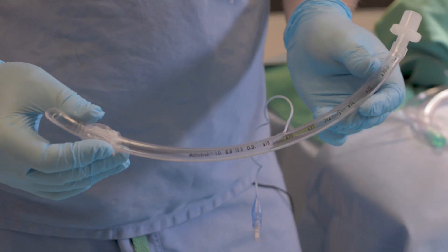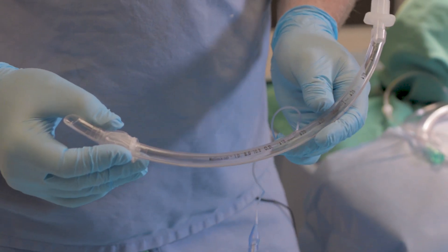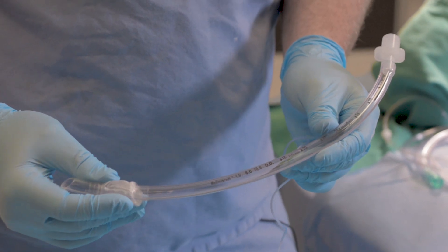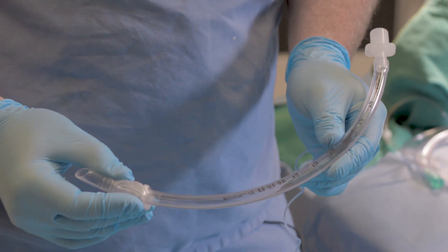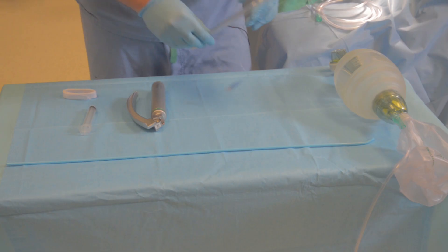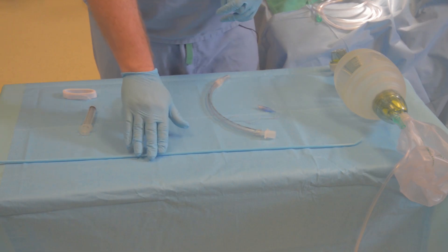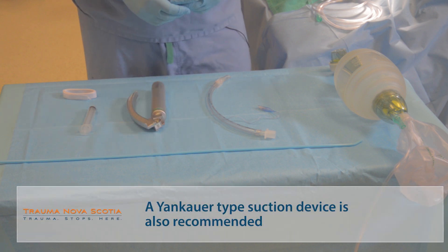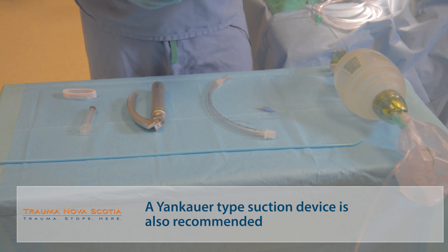You need an endotracheal tube. This is an 8-0 endotracheal tube. Appropriate sizing for the average adult male patient would be a 7½ to an 8½ tube, one half size smaller for female patients. A bougie should be on the chest of any patient whose airway you're managing — not necessarily as a rescue or difficult airway device, but often as a primary intubating device, particularly for those of us who do not intubate or manage airways on a regular basis.